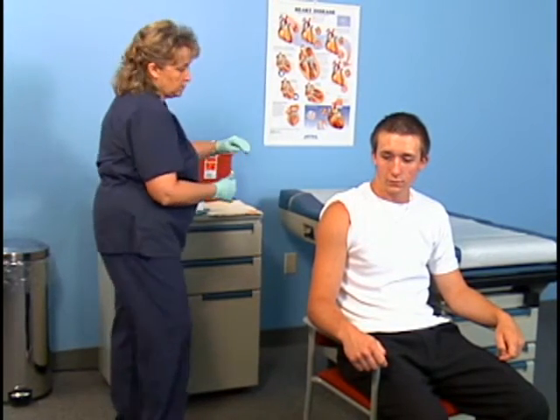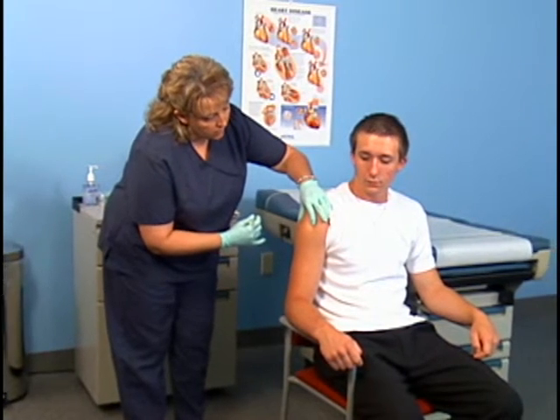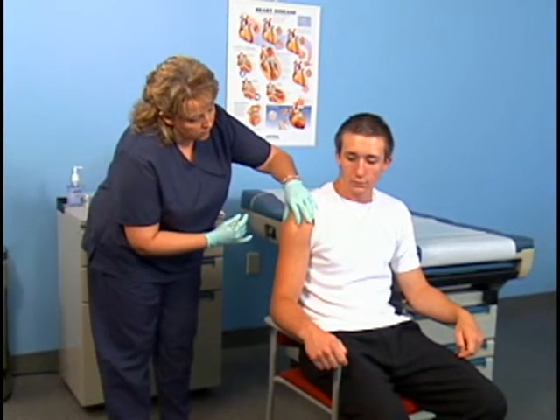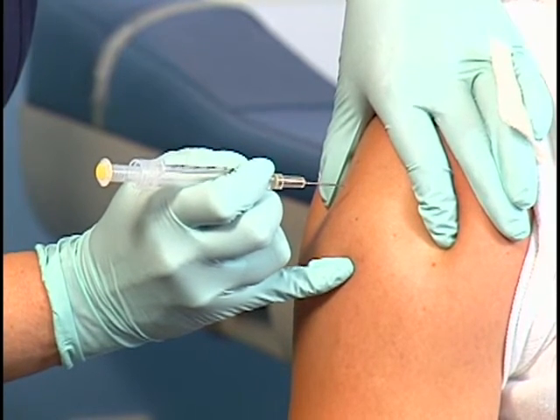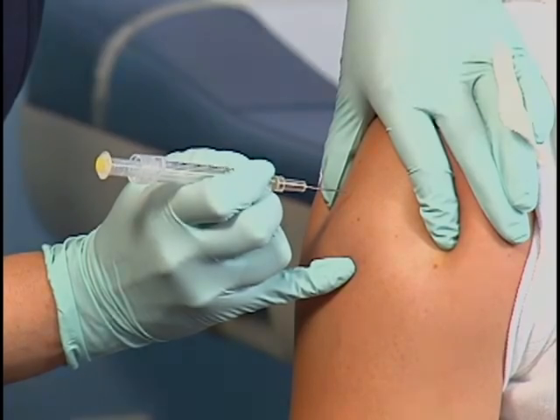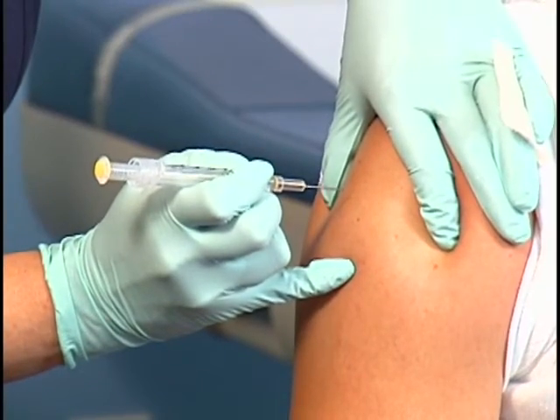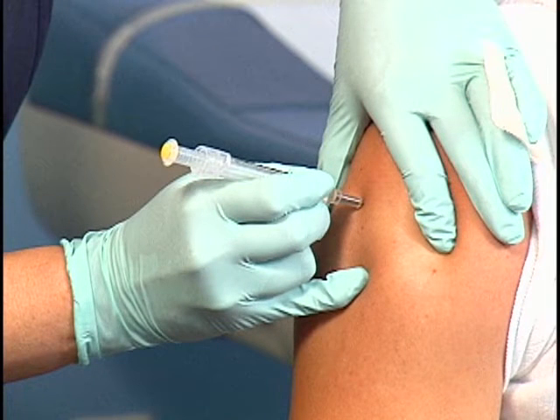Position your non-dominant hand on the area surrounding the injection site. Stretch the skin taut over the injection site. This permits easier insertion of the needle and helps to ensure that the needle enters muscle tissue. Hold the barrel of the syringe like a dart and insert the needle at a 90-degree angle to the patient's skin. Insert the needle quickly and smoothly with a firm motion to minimize tissue trauma and pain. Insert the needle to the hub.